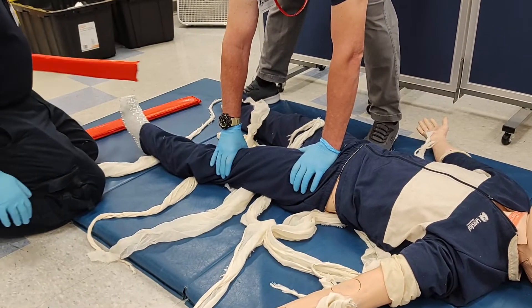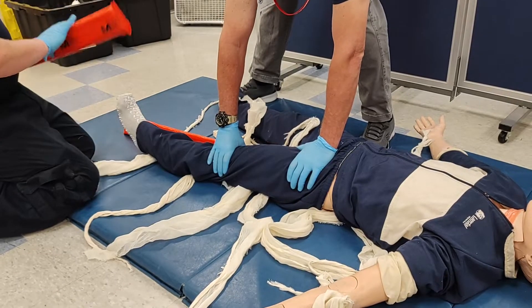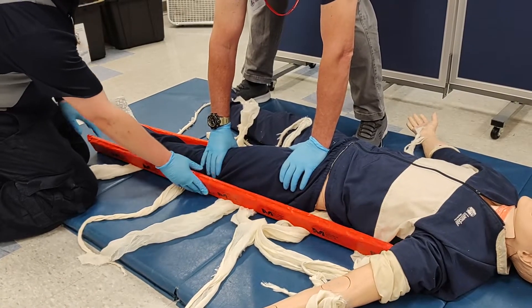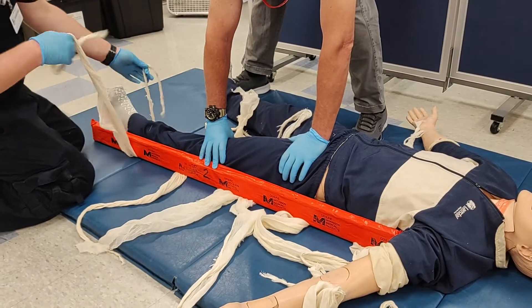The medium splint will be placed on the inside of the patient's leg with the soft side towards the patient, and the long splint will be matched up with the bottom of the other splint, extending up into the patient's armpit.